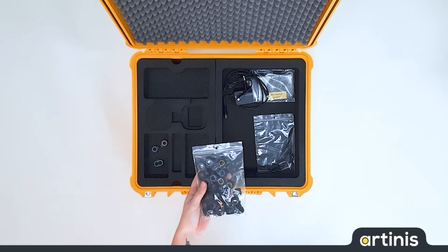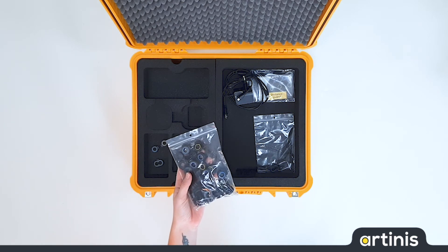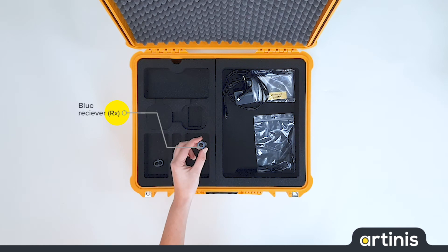The optode holders are used to place the receivers and the transmitters of the Brite in the head cap. The yellow holders are for the transmitters and the blue holders for the receivers.